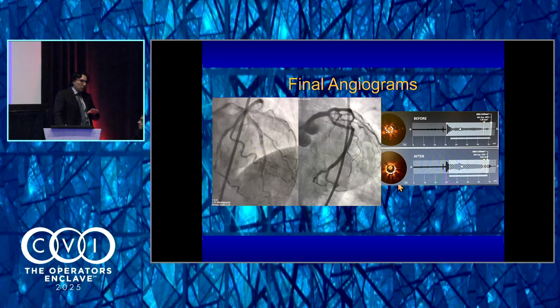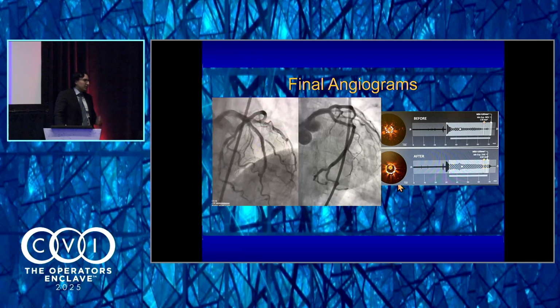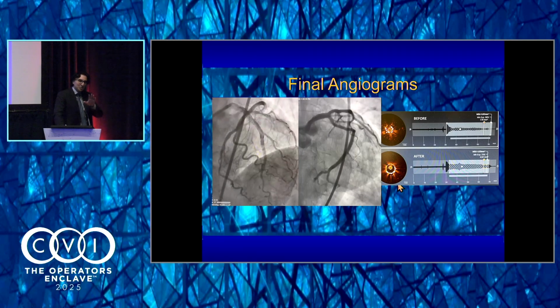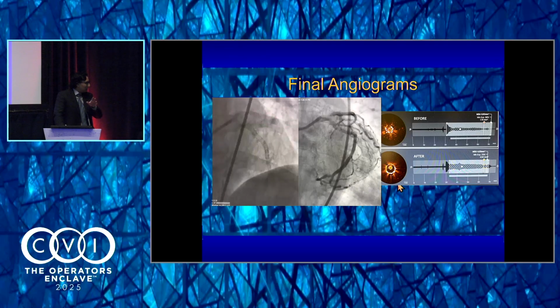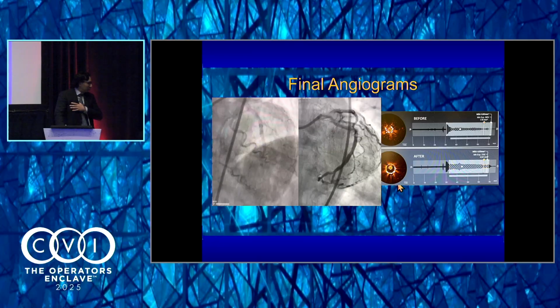The things I was going through here, I even got contralateral access in the other groin, thinking, God forbid, there's a perforation, I'm going to need to put an Impella right away. So maybe I was a little bit conservative in my approach with the OPN and pre-dilating.